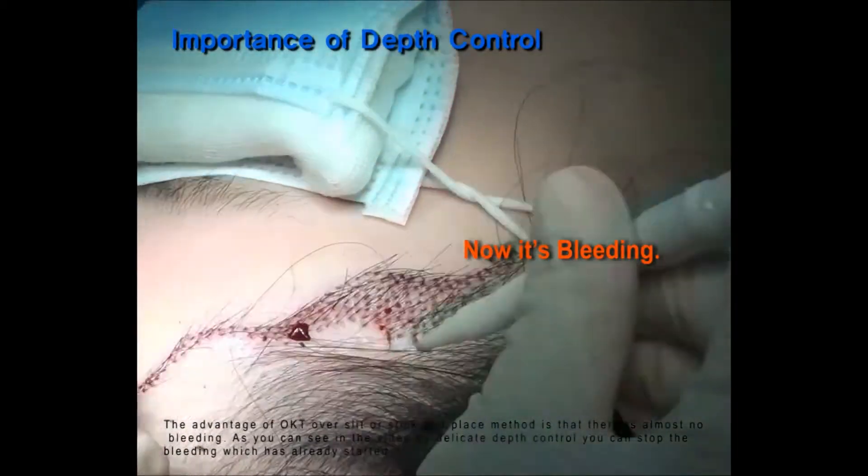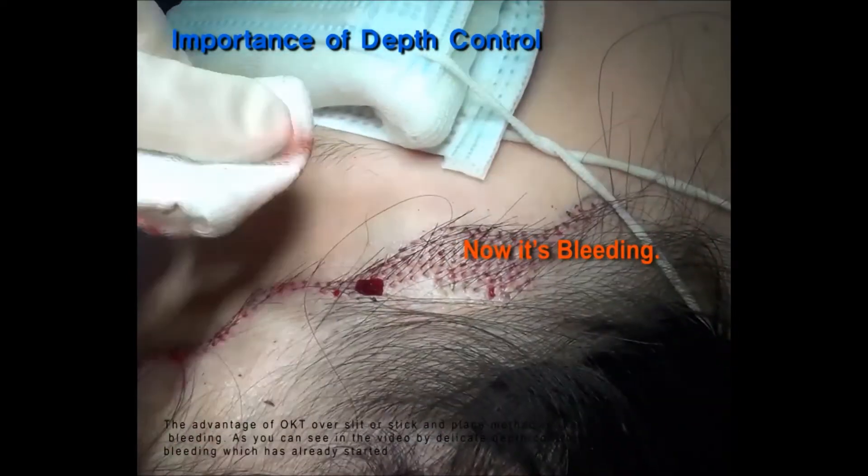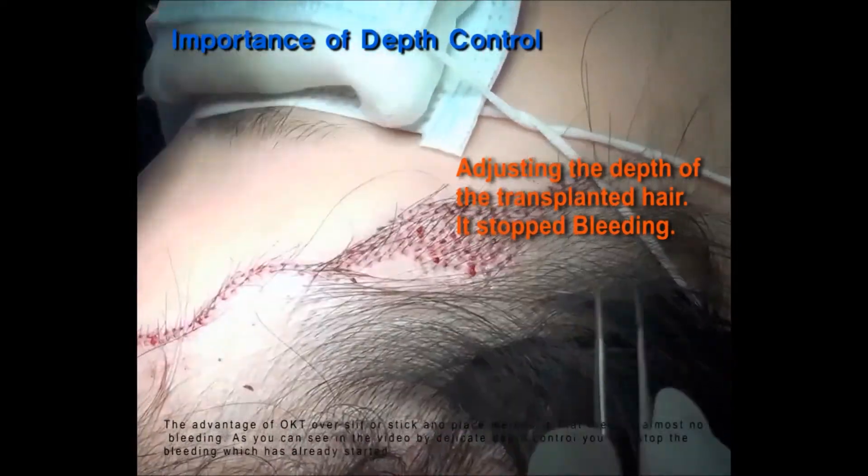The objective of the OKT slit or stick-in-place method is that there is almost no bleeding. As you can see in the video, by the delicate depth control, you can stop the bleeding which has already started.